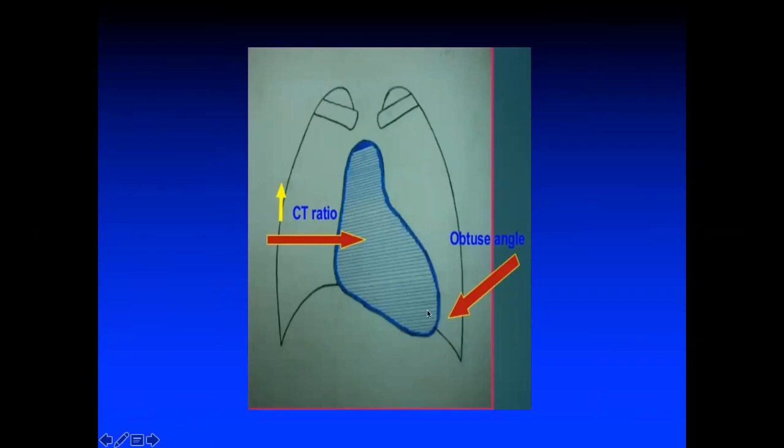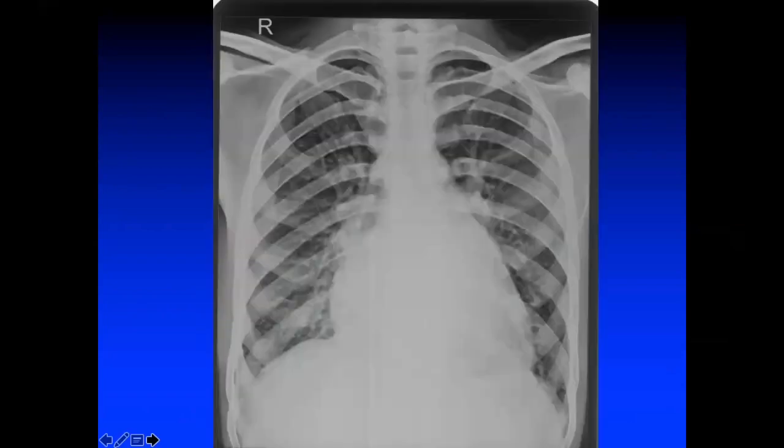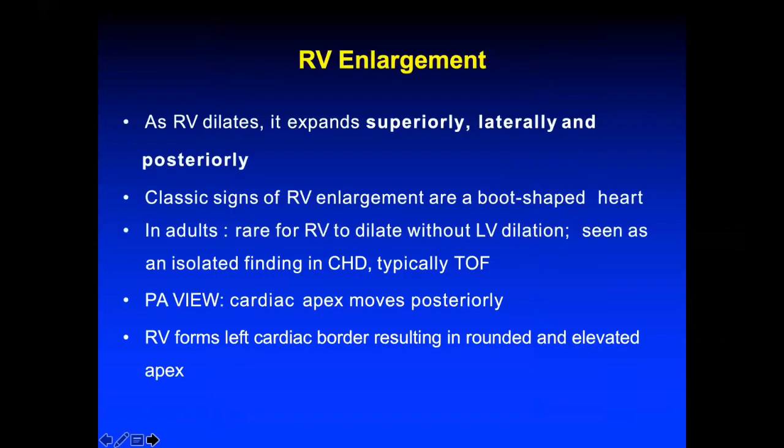If it would have been an acute angle, so whenever you're seeing an RV apex, you can just say how an acute and obtuse angle are different. Just see this diagram. Here, this is the angle. If it is more than 90 degrees, that is an obtuse angle. When you see an RV apex X-ray, you will be clearly sure what the difference is.